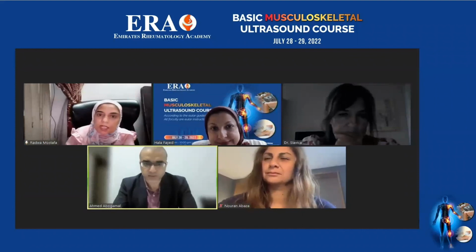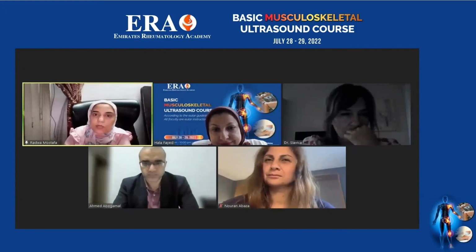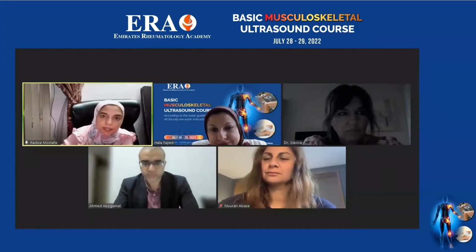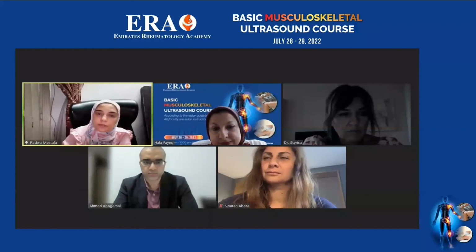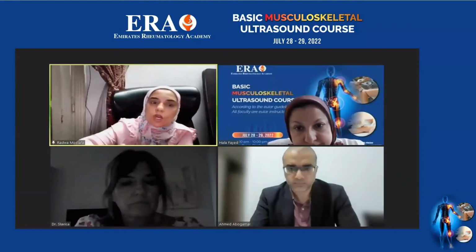Yes. We will see the pathology around the 2 millimeters, according to the Doppler definition of enthesitis. We have to assess it about 2 millimeters from the enthesial sites, with the Doppler signal present around. When we have a chronic enthesitis, we have an erosion, more specific for the inflammatory type. Even though it can occur in the mechanical type, the mechanical is associated with more tendinopathy of the tendon, more than 2 millimeters away from the insertion sites. So we have special spaces.